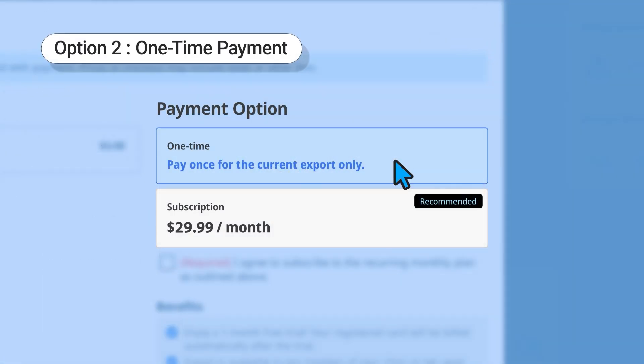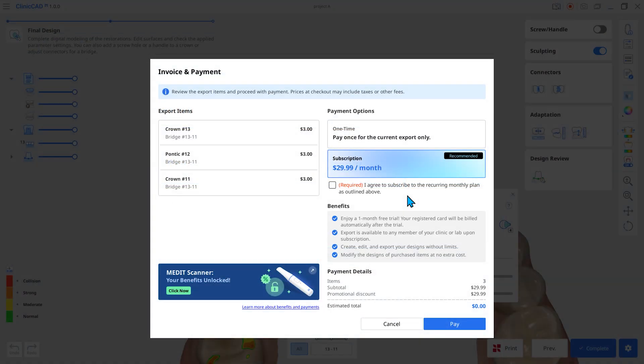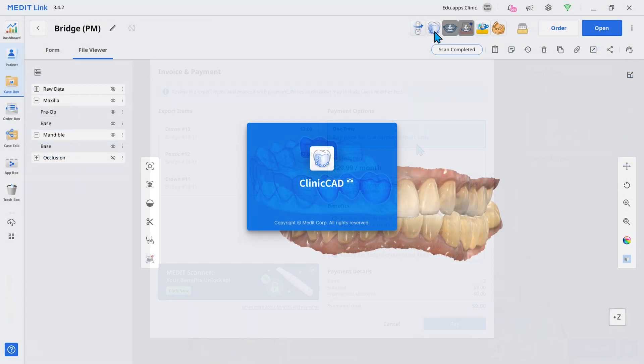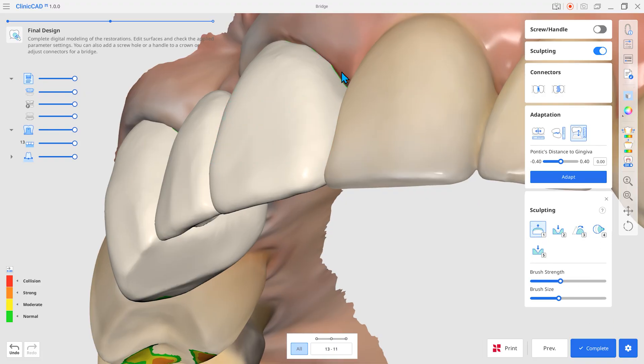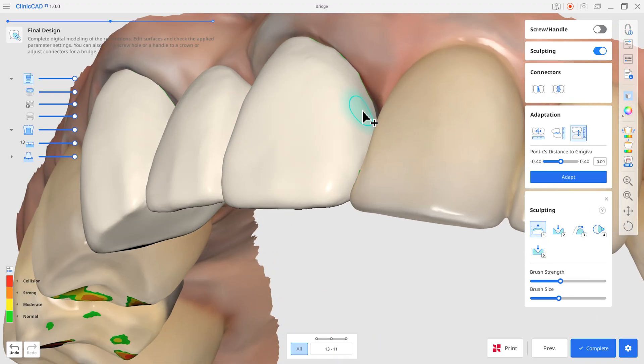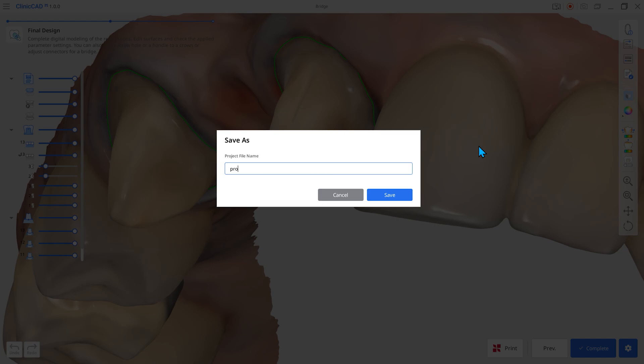Option two: one-time payment. This option allows you to pay once to extract a single design file. Let's try the one-time payment in the Medit ClinicCAD app. Once the design is completed, enter the project name and save it.